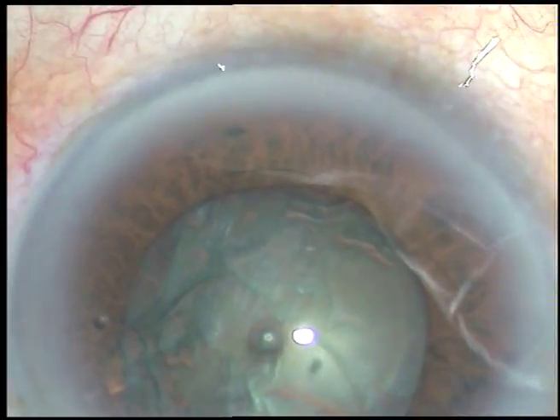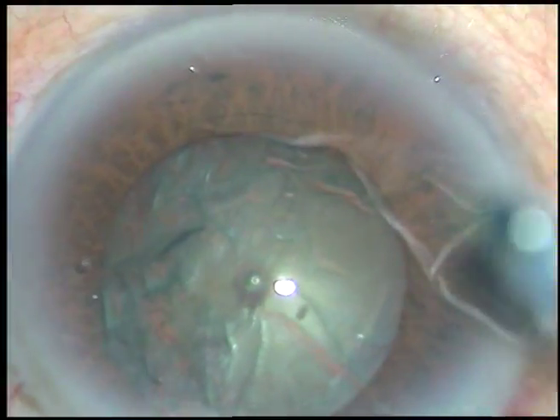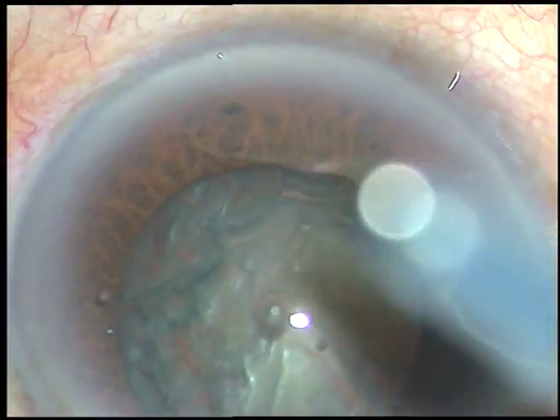By this time, hydrodissection has been done. See — the pupil is dilating when we are injecting viscoelastic, and when the viscoelastic is coming out, the pupil is becoming small.